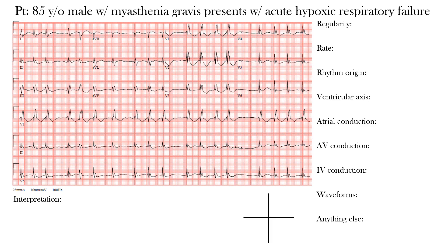Our 85-year-old male with a history of myasthenia gravis presents with acute hypoxic respiratory failure. Let's go through the EKG. First, we look at the regularity of the rhythm. On first impression, the rhythm appears irregular — not only irregular but irregularly irregular.